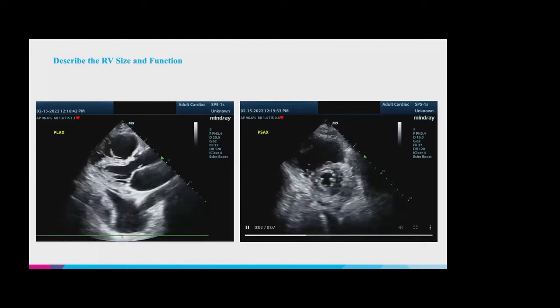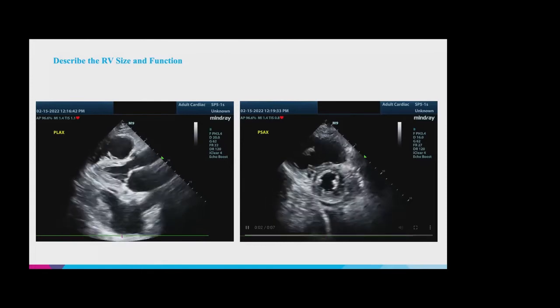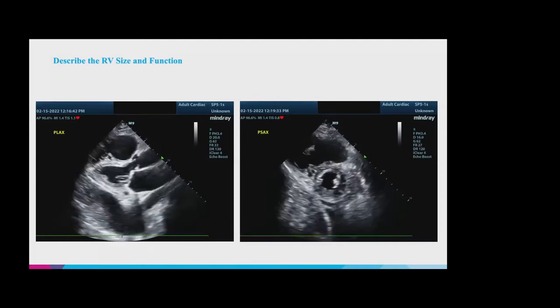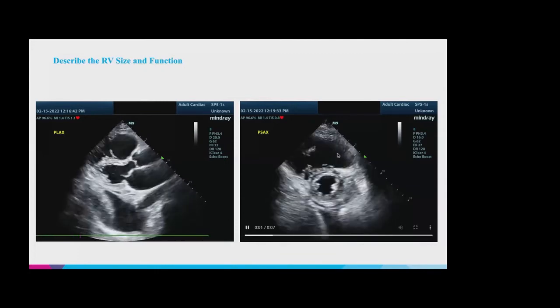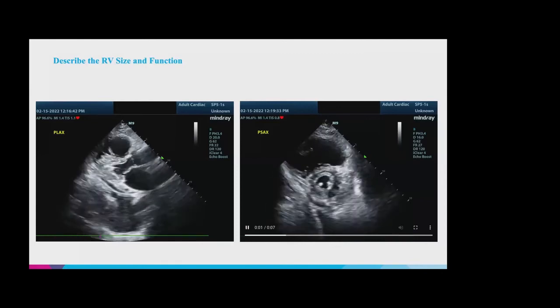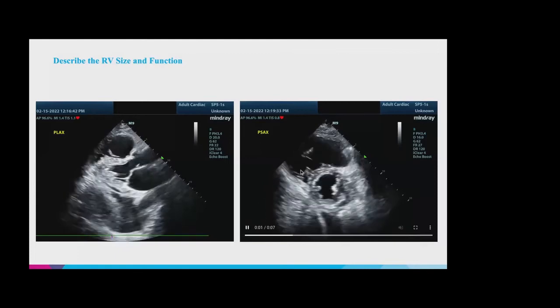Of the right ventricle, like it's depressed. When it's that dilated, you are expecting it to be reduced function already. Yeah, but especially on the short axis, it looks better because it looks like it's contracting a little bit. On the long axis, but on the short axis, I don't know if it's because of my camera, like the internet connection. Yeah, it's definitely huge, right? It looks almost double the size of the left ventricle, right?